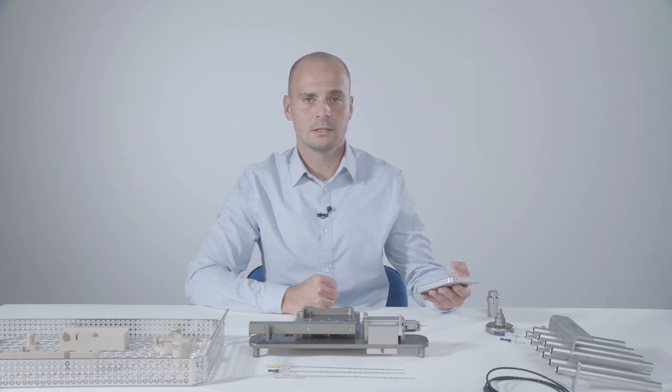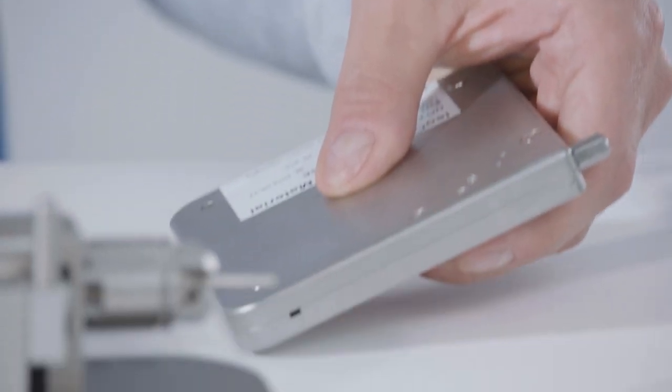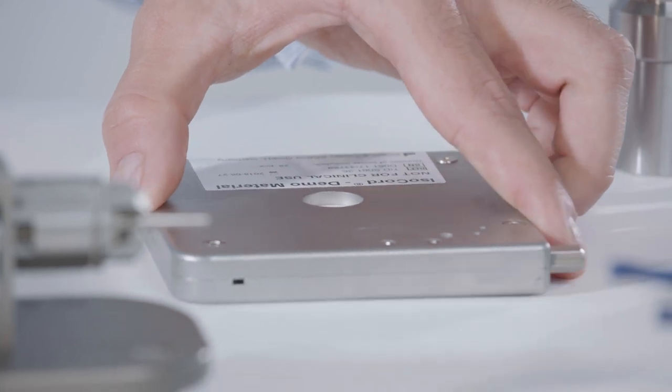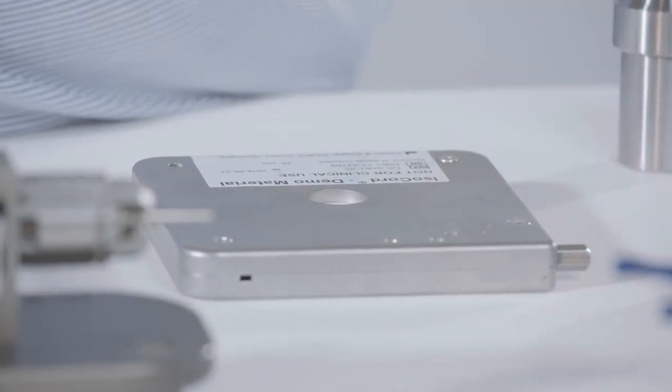The isocord magazine is fitted with a transport locking device so the seed chain cannot move unless the magazine is placed in the needle loading station.